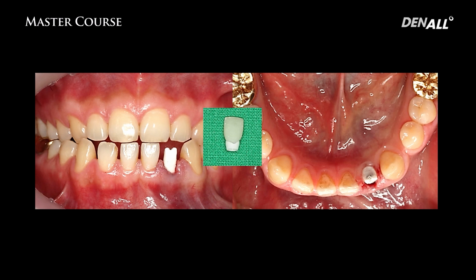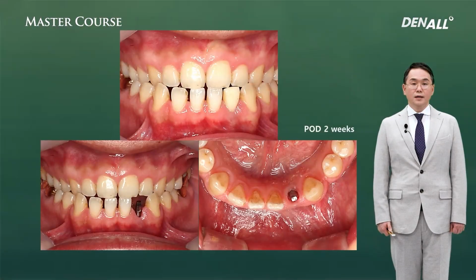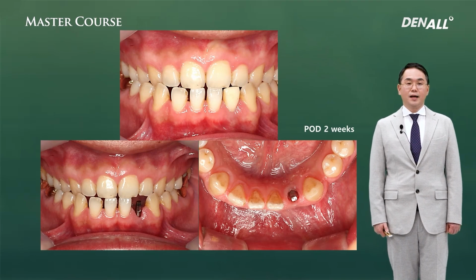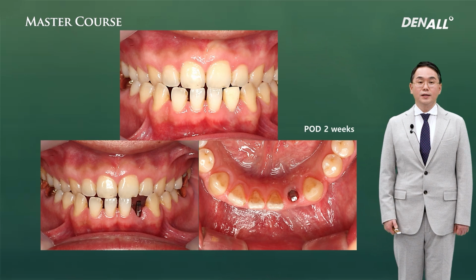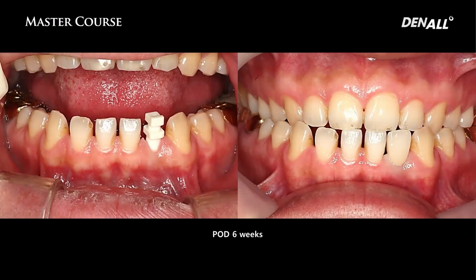That means the abutment part of the MS implant is not cemented, but the provisional cap is clicked on. That is a big plus for the prosthesis. If you use cementation, the excess cement could cause infection or gingival inflammation, so you can do without it. Easily, the temporary prosthesis can be connected like this. After about 2 months, the gingiva is healed like this. It is properly healed, and the cement is not used at all, leading to good gingival response.